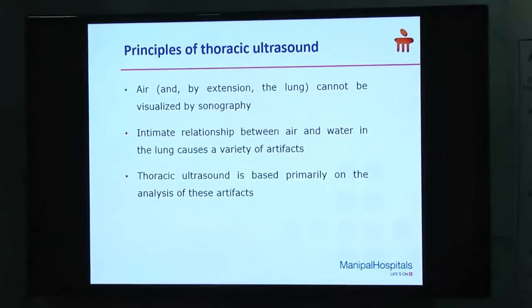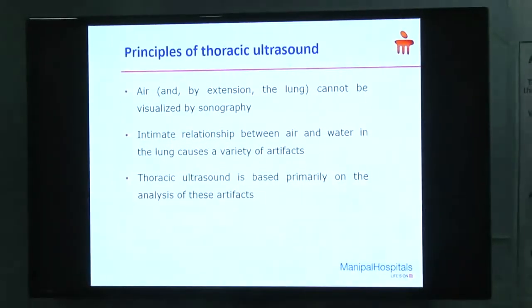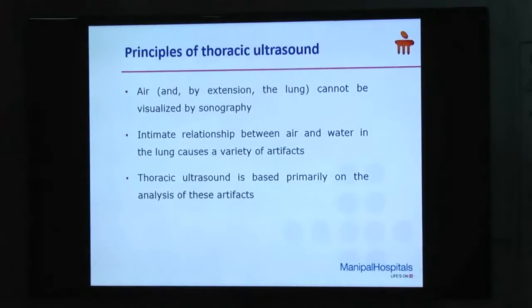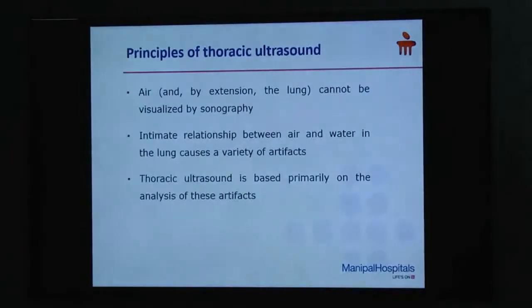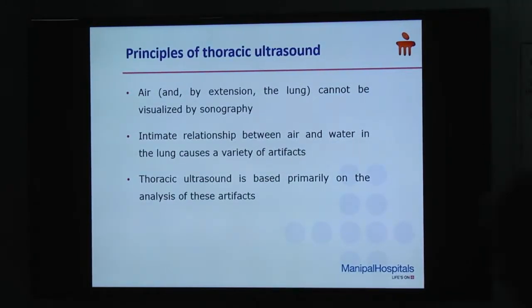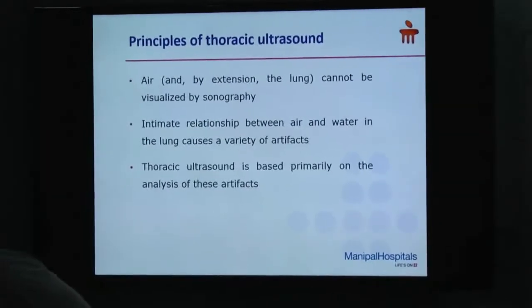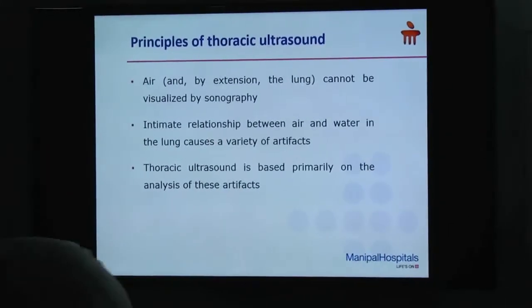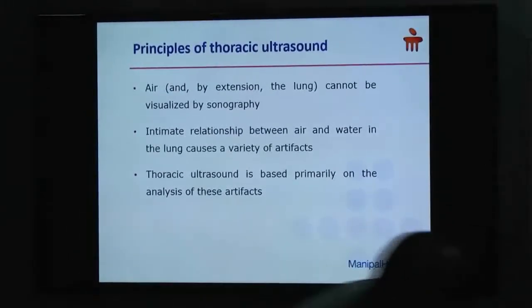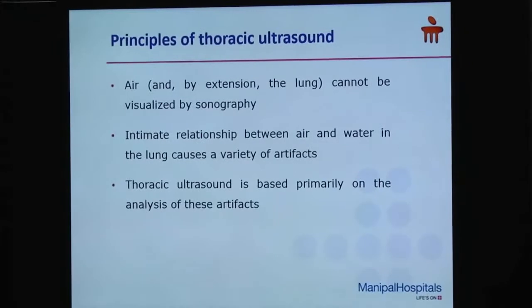Now what happens is whenever there is a pathology in the lung, there will be some fluids, and it is the interaction of the ultrasound waves between this air and fluid that creates a lot of artifacts, and lung ultrasound is mainly about the study of these different artifacts. Fortunately for us, these artifacts are very specific in each disease, and by study of these artifacts you will be able to make a lot of diagnoses.